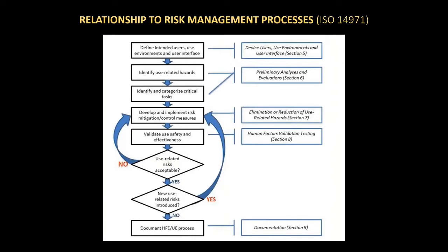And of course, through the normative testing process, we may have to rinse and repeat and come back, and that may be a loop until we end up at something that is working, that has a low level of risk and a high user understanding.